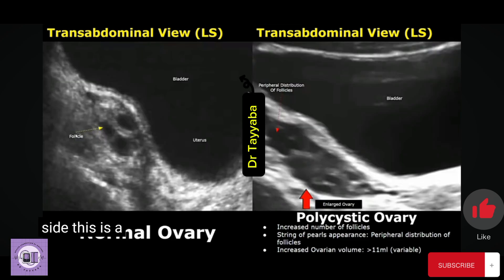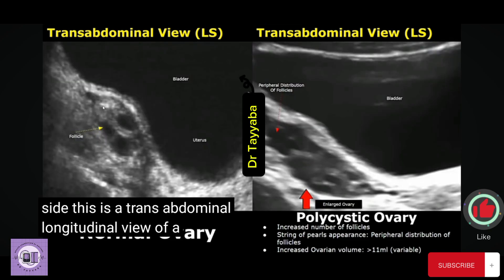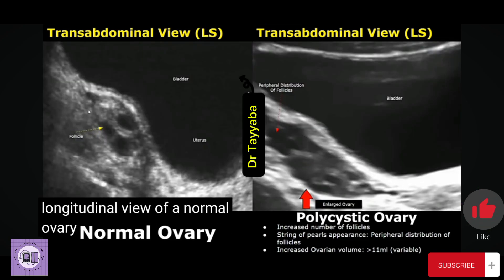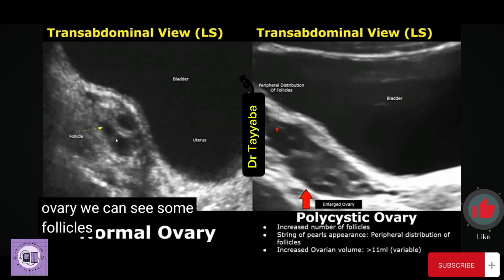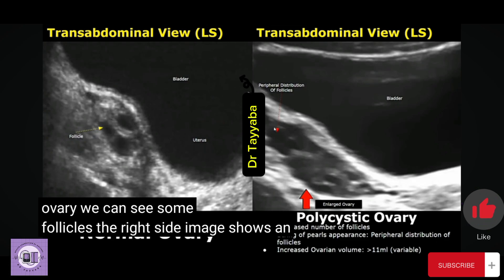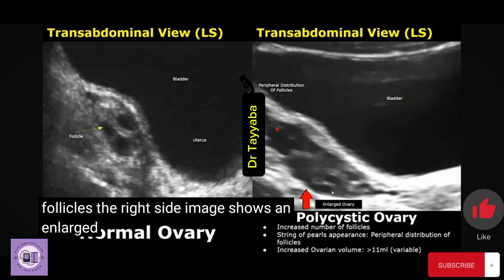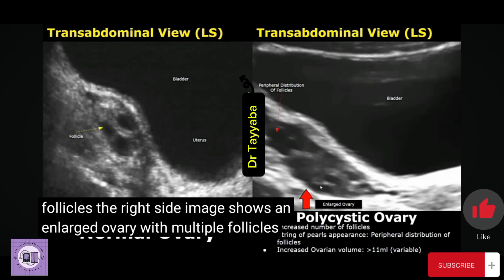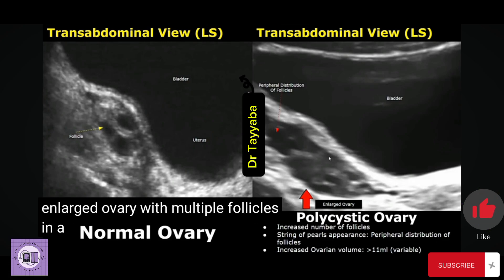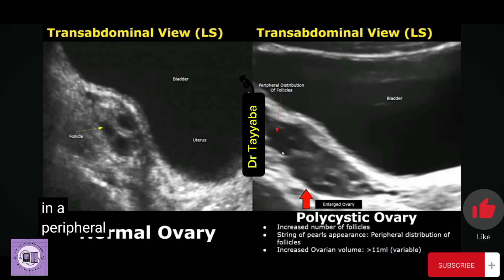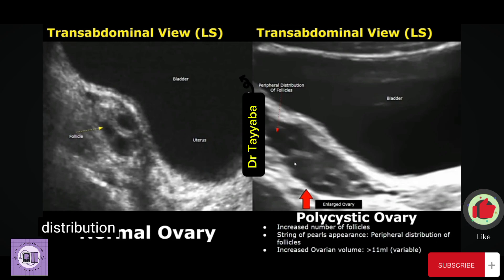This is a transabdominal longitudinal view of a normal ovary, where we can see some follicles. The image on the right shows an enlarged ovary with multiple follicles in a peripheral distribution, consistent with polycystic ovary syndrome.